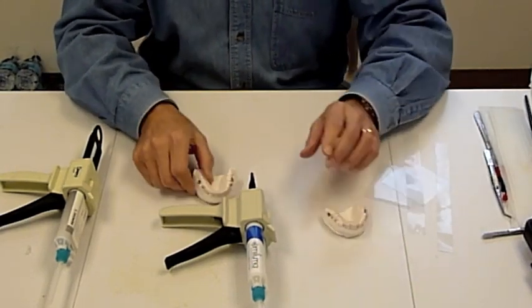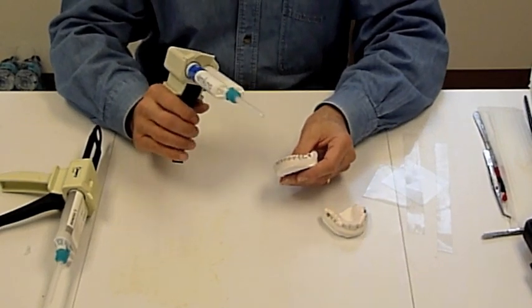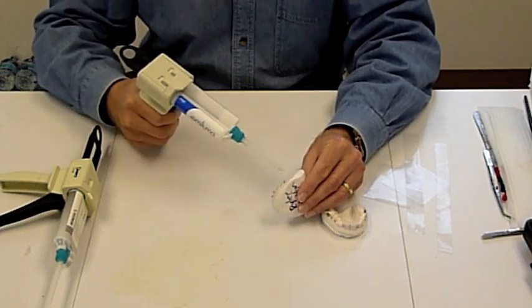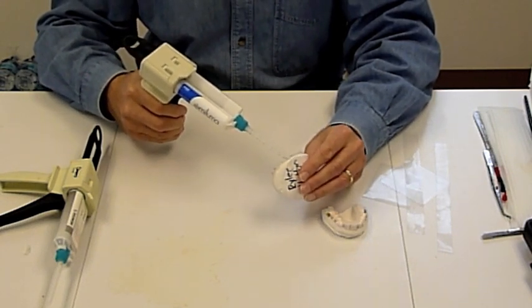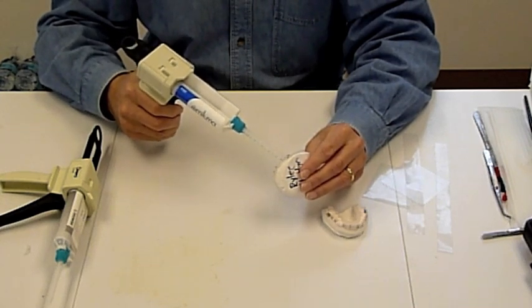So we'll go ahead and make the lower tray with the emiluma. The way to use the emiluma is to express a small amount just on each bracket, push the emiluma in place to cover the entire bracket, no more.